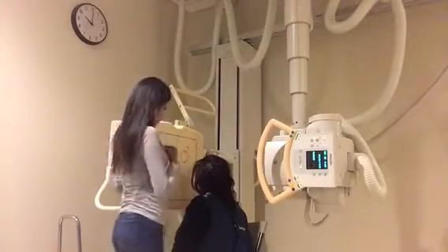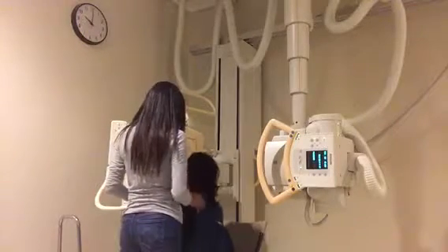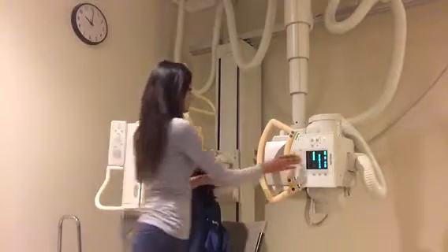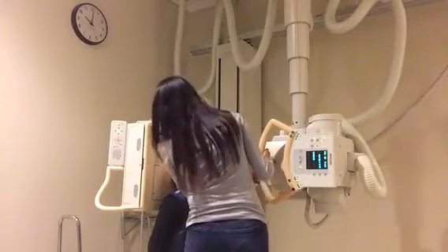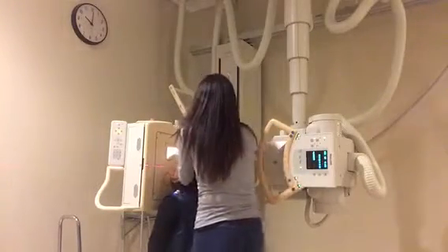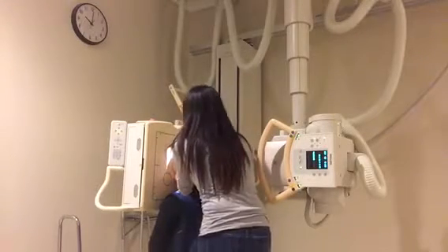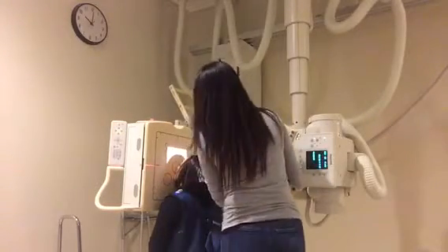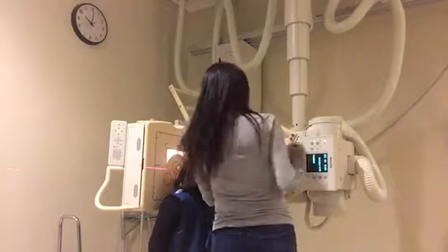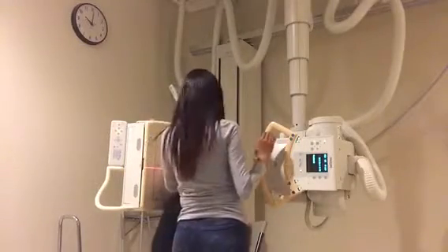So have you just scoot into the bucky. Take your chin off just for a second.